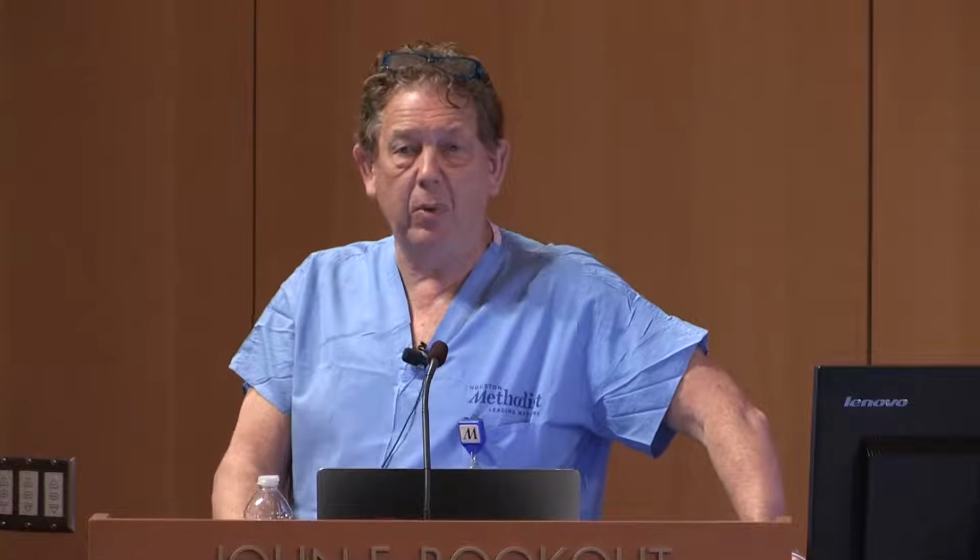So very frequently at the top end of a stenosis or an occlusion, there are collaterals which come off, and that's where the wire tends to end up going. You put the wire down there, it's not going to go straight through the occlusion for you, it tends to deflect and go down through these collaterals. And that's where you need to be able to steer that wire away.